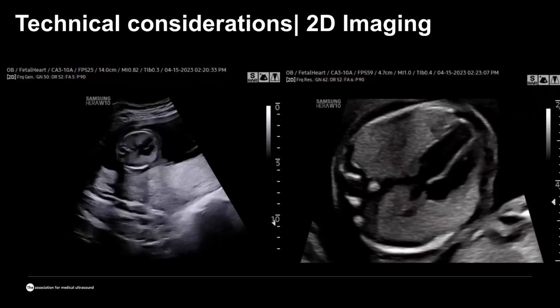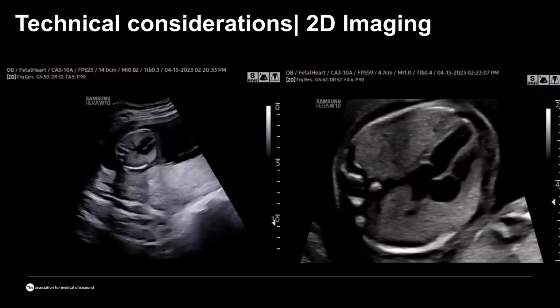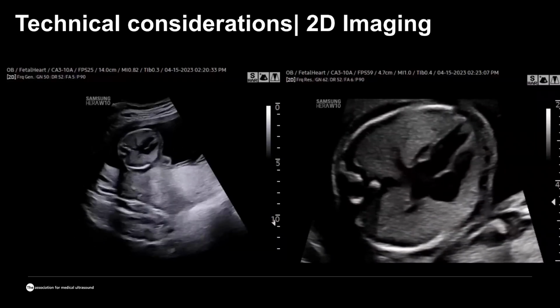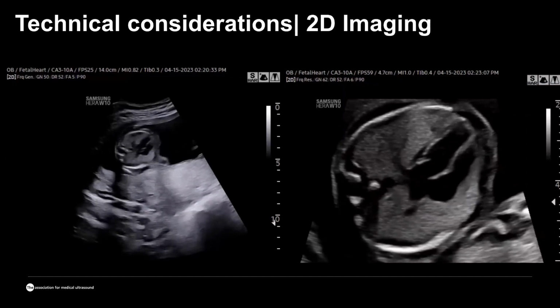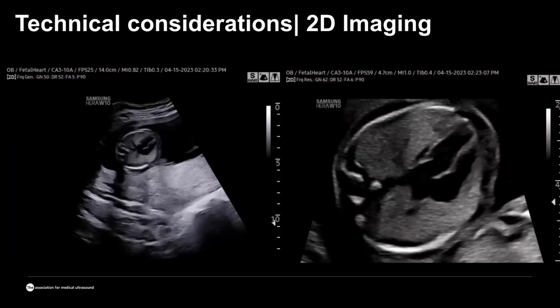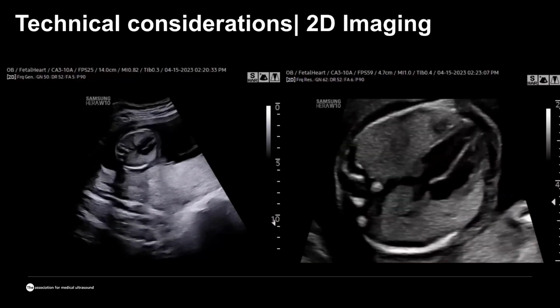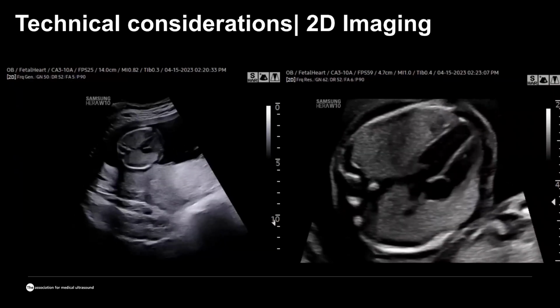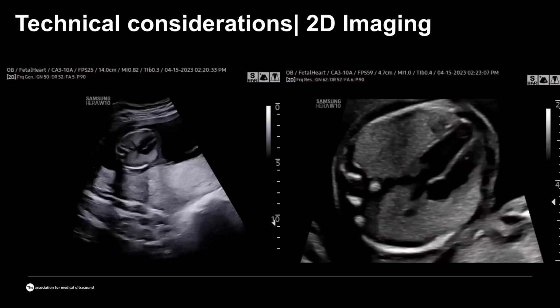It is well known that cardiac anatomy is very, very complex, and we deal with abnormalities where more than 200 different types of cardiac malformations are described. Some of them are less complex, others are more complex, but in order to make an exact and precise diagnosis, we need to make sure that we optimize the image correctly. It's not always an easy task, and I'm going to show you how the new tools and new developments in ultrasound technology, including the physics of beam forming, can help us overcome all those difficulties.